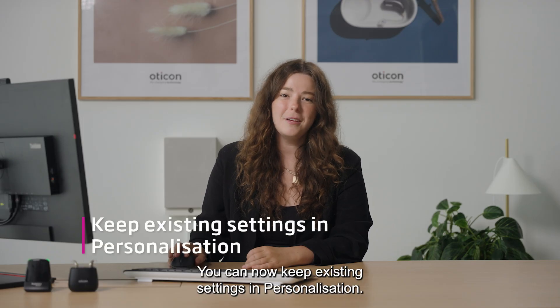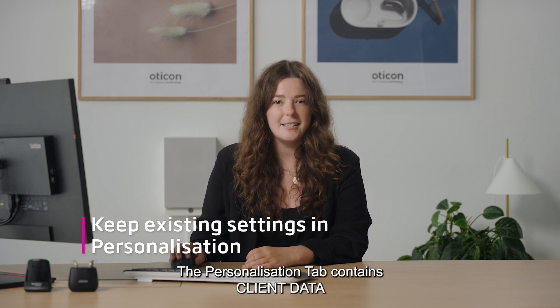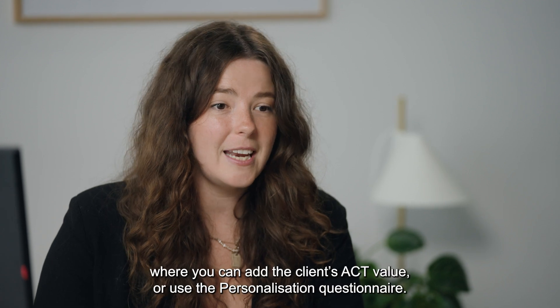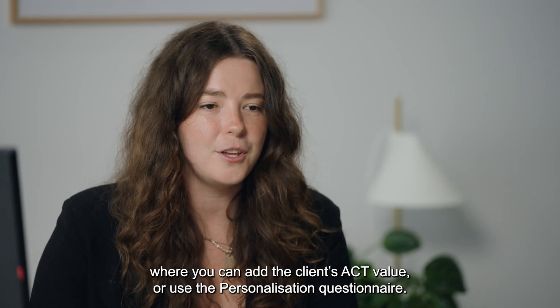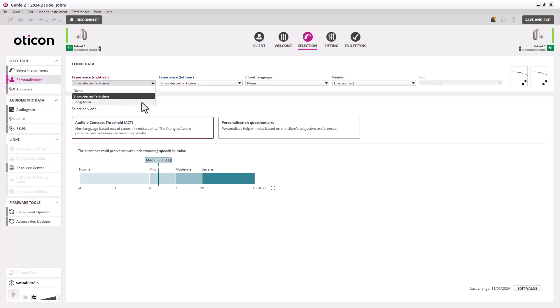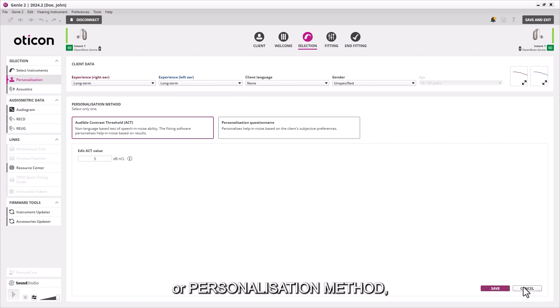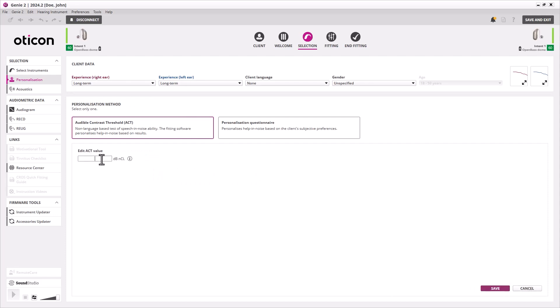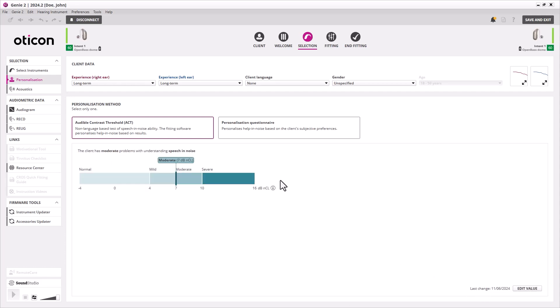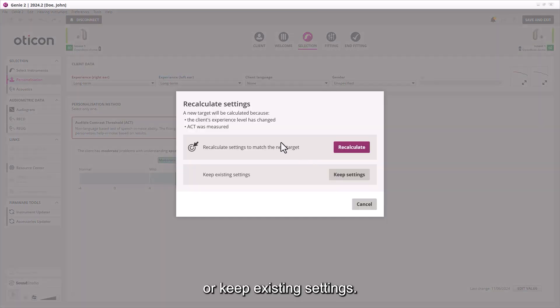You can now keep existing settings in Personalisation. The Personalisation tab contains Client Data and Personalisation Method, where you can add the Client's ACT value or use the Personalisation Questionnaire. When any information is changed under Client Data or Personalisation Method, you will be asked whether you would like to recalculate the settings or keep existing settings.